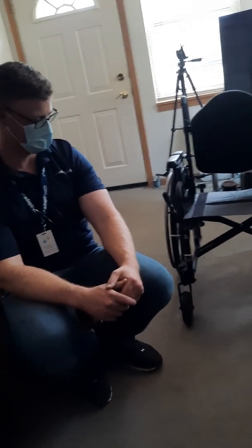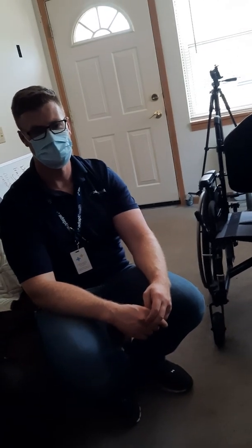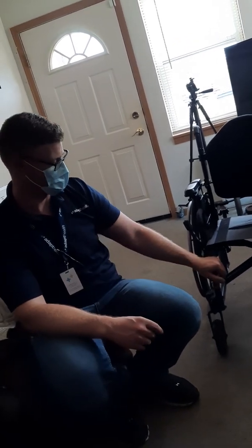Something as small as getting the right size caster wheel can make a big difference in how somebody's able to get around in their house, or whether it's a soft roll caster or a hard one, and that's going to make them feel like they're going to chatter their teeth out of their head when they go over a bump. Helping people choose the right equipment and figuring out how you can make other things work for them kind of teaches you that skill of how to MacGyver things into the right thing for the client, and that carries over into your home too, into your personal life. You know how to problem solve a whole lot better and come up with creative solutions that are going to work and last a long time.